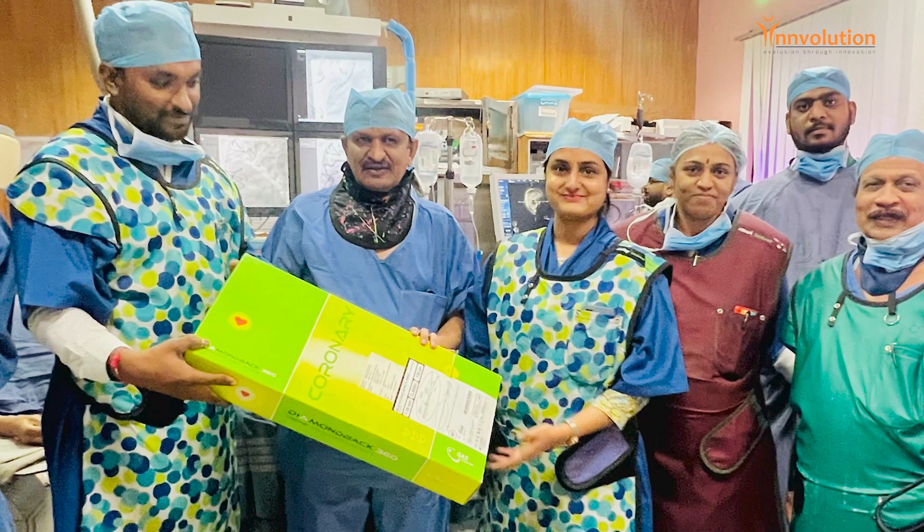I am very much impressed about the way this crown moves across a tight lesion. Initially, even a 1.5 mm balloon was not going across the ostium of the RCA — it was super tight. Even in this heavily calcified, tight lesion, the crown movement is very smooth. It's a great addition to the debulking armamentarium.